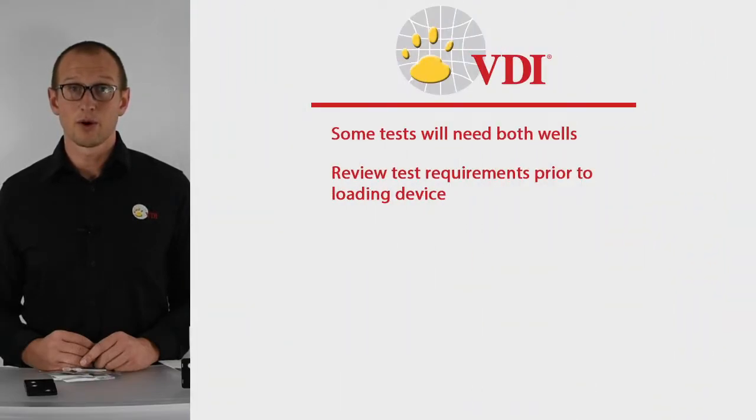Some test configurations require both wells to be filled. Please review the test requirements prior to beginning.